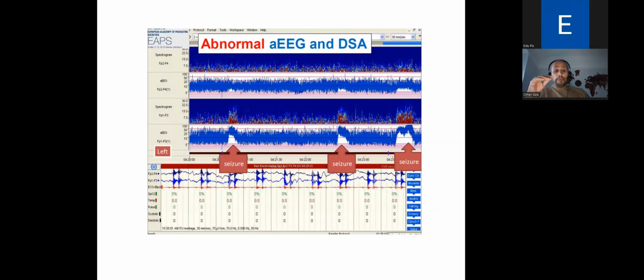So you can be confident in saying that this is a left-sided seizure with secondary generalization to the right. For this completely sedated and muscle relaxed patient, it gives you some indication of what's happening in the head, to make the diagnosis of potential seizures and decide what you would do about it.